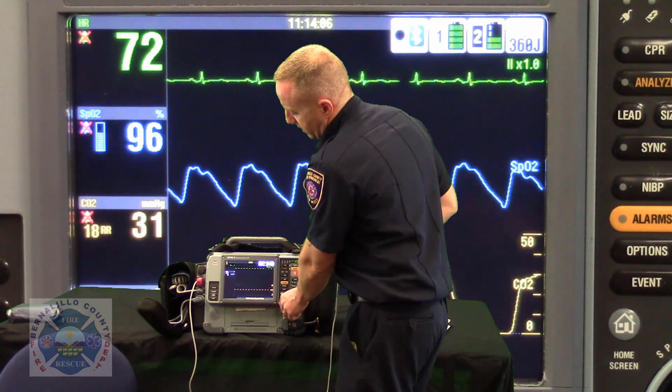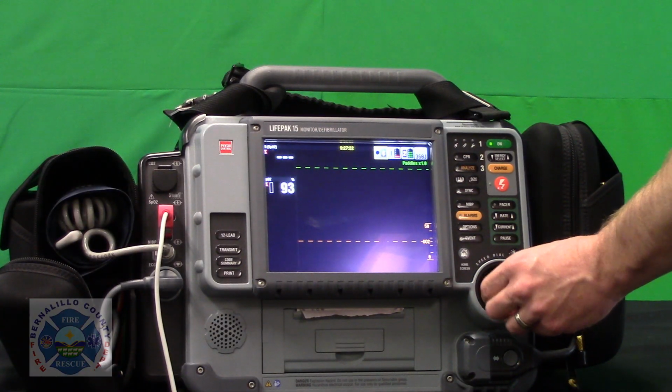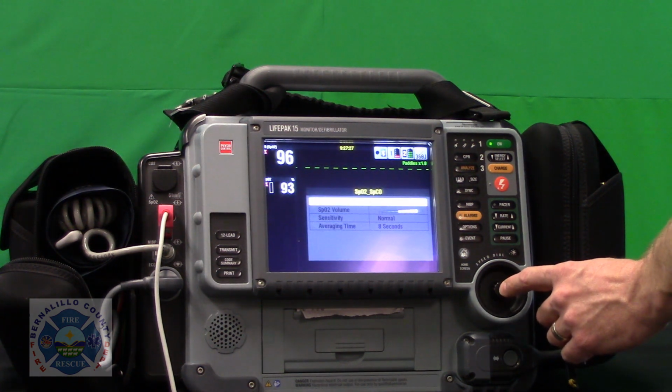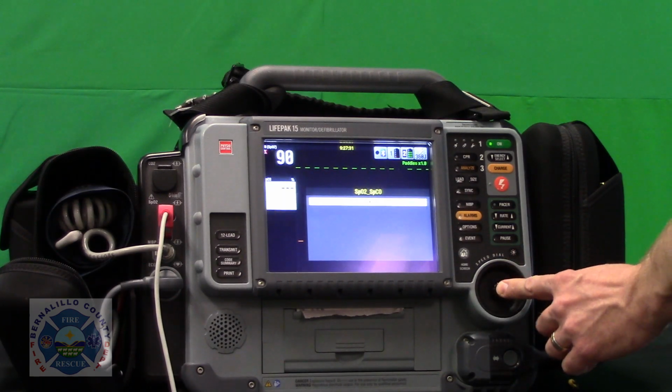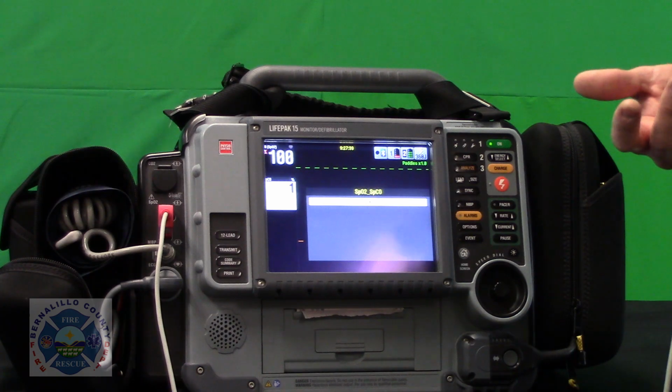Well, this is kind of interesting. You're going to use your speed dial. You're going to scroll over to your pulse oximeter reading, and maybe you just want to see if there's an SpCO concern. So we'll let the monitor sort of cycle through and see if it sees any SpCO. And it's registering a 1% SpCO, clinically insignificant.